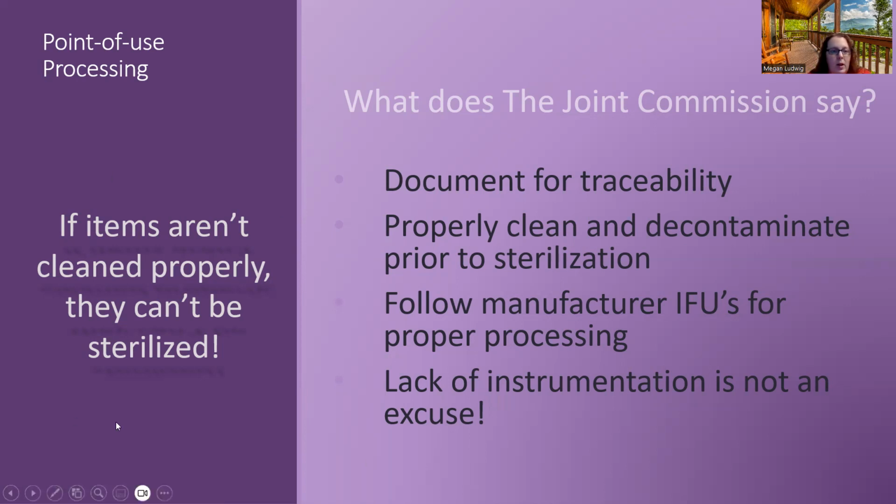So they say, in reference to sterilization, if items aren't cleaned properly, they can't be sterilized properly. This is going back to point of use processing, right? You have to clean it first before you can sterilize it. Along with that, they also want you to document anything that you put in there, just in case something comes back.